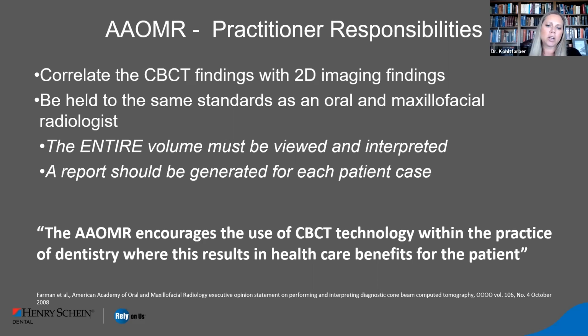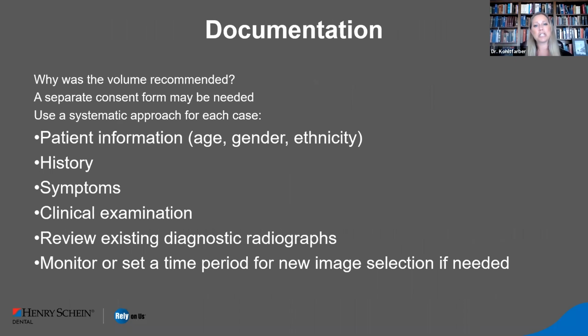It says the AAOMR encourages the use of CBCT technology within the practice of dentistry where this results in healthcare benefits for the patient. So there has to be some type of a benefit for the patient. We have to be able to establish there was a benefit. Basically, we need to say why we took the scan. And that will come up again later with our documentation. Why was the volume recommended? And that's very easy to say.